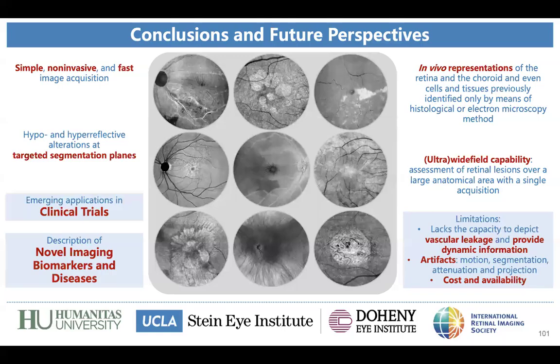So hopefully, if we can train artificial intelligence systems to detect diseases better and better, I think this would be a game changer. So absolutely. What do you think about that?